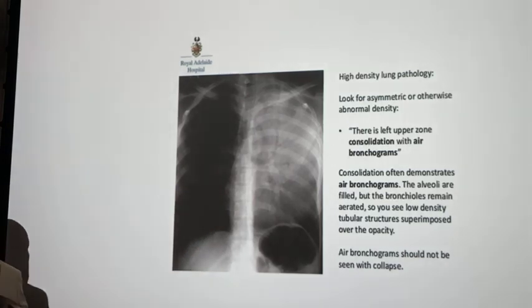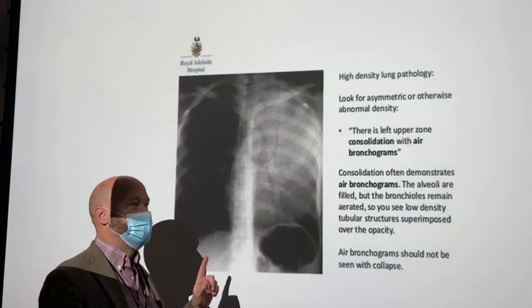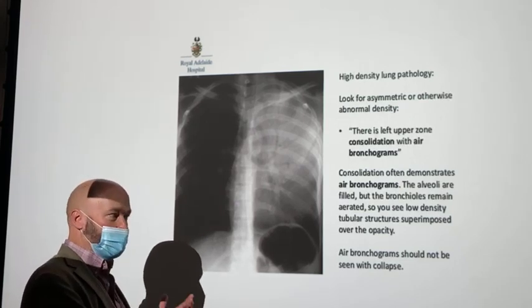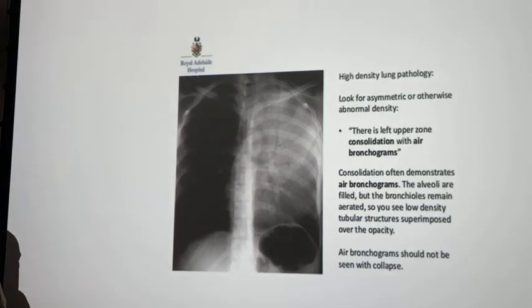Okay. You need to hang on to that all the way through the registry because almost every registry review book has a question like that on it. You shoot a lateral chest x-ray with the outer cells activated, you get underexposure, gross underexposure.